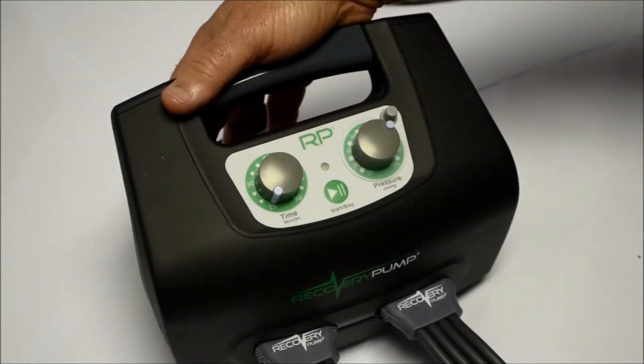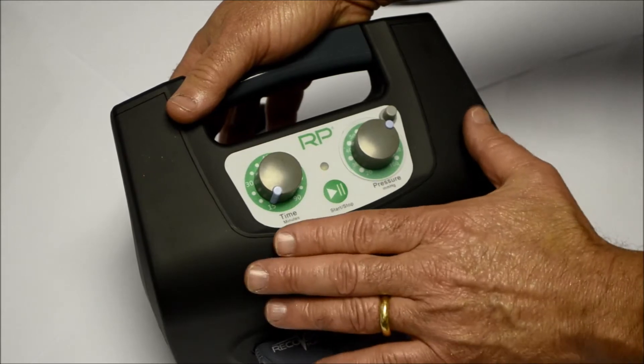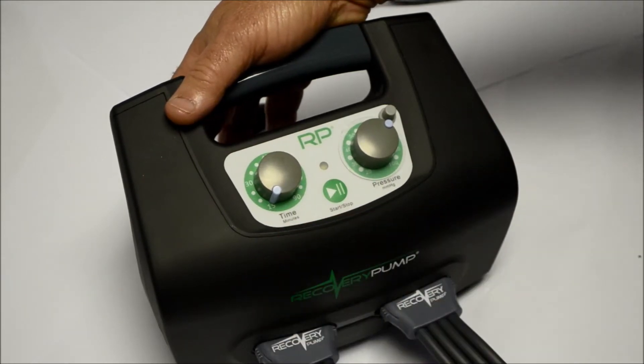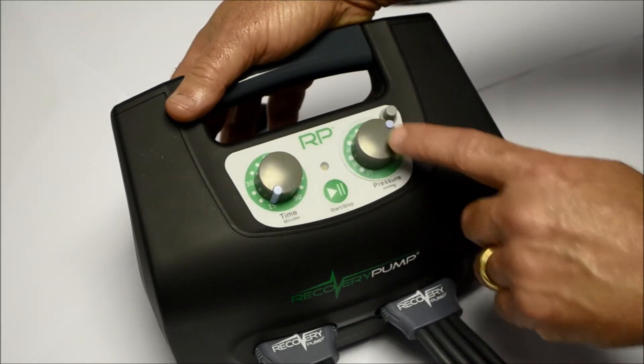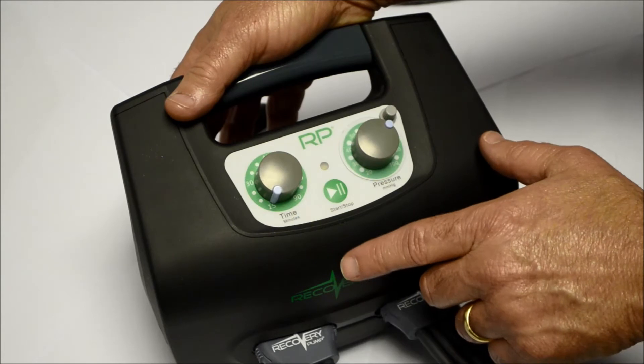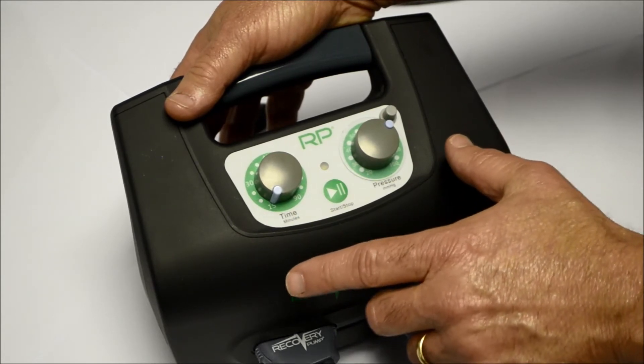The first of our two new models is the RP. It's economical, portable, and has two functions that you can control: the time and the pressure. There's also a default function that indicates how long the deflation cycle will be before the next cycle starts.